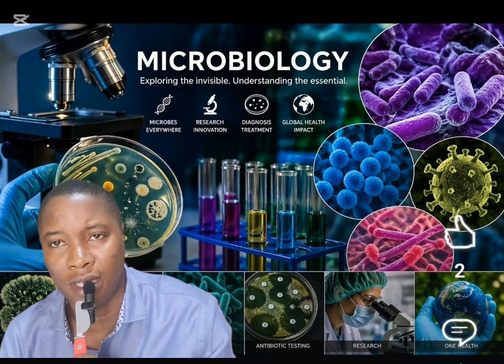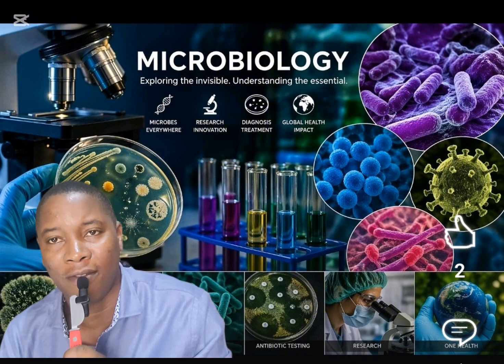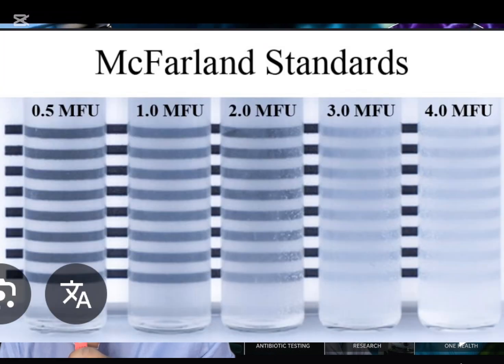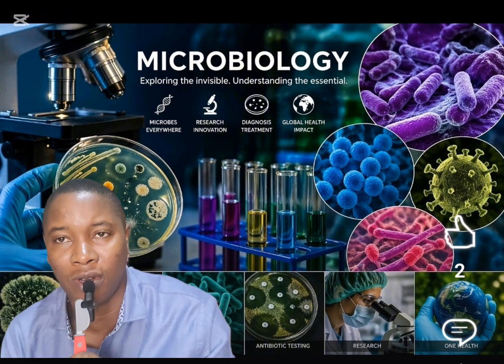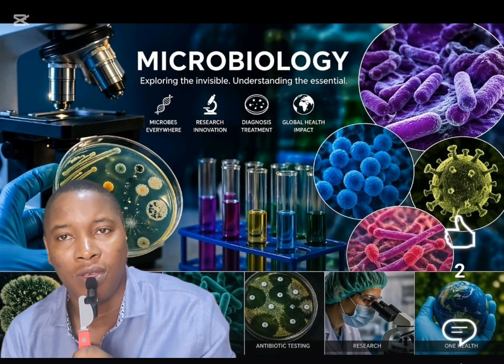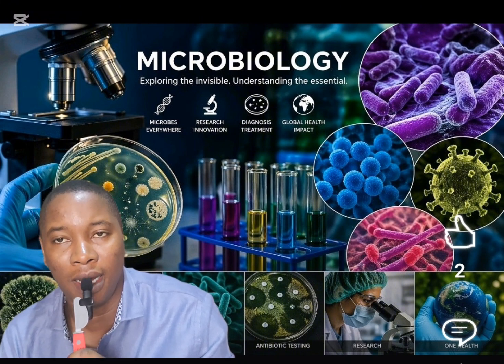In the process of running the test, like I said before, we use Mueller-Hinton agar, which is a special agar we use. We also have what we call the McFarland standard, which is important. Now, this is a method where we use turbidity. We use turbidity to determine the amount of bacterial cells which we'll be inoculating onto our plate. And what does this mean? To standardize the test, you want to have a situation where you are taking approximately the same amount of bacterial cells and inoculating them on the petri dish.